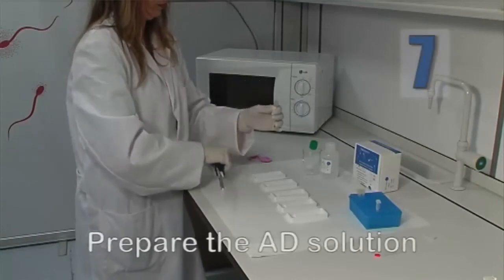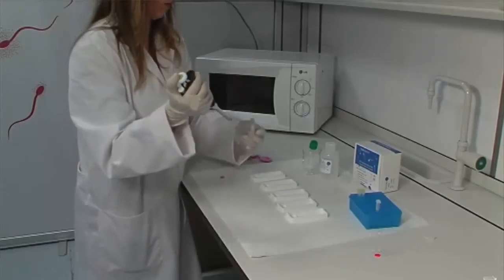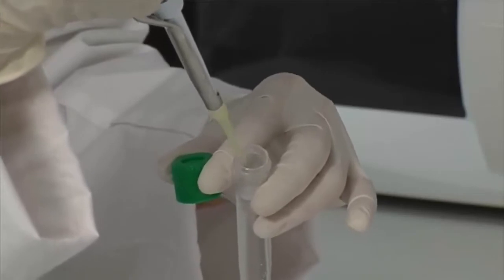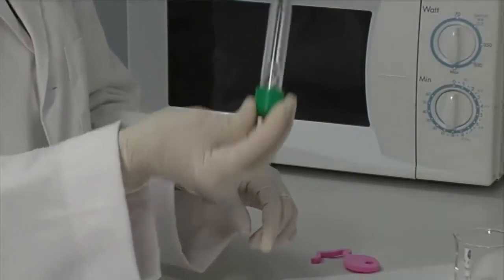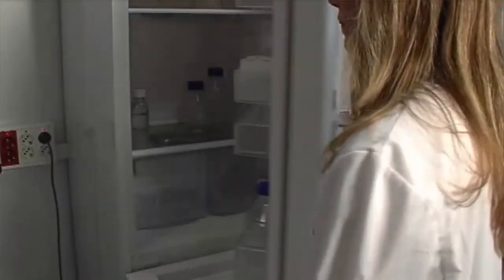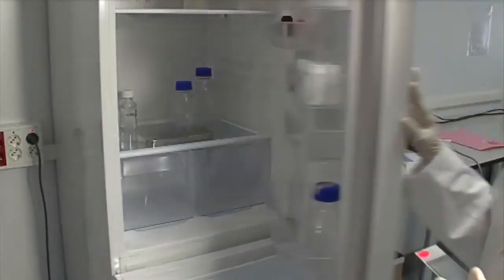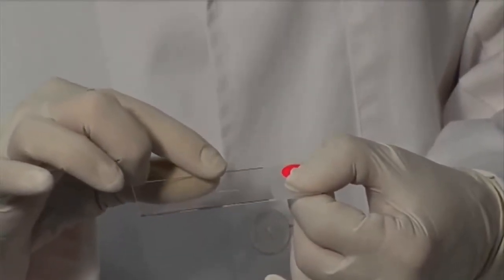Whilst the agarose is setting, prepare the denaturing solution AD by adding 80 microliters of the AD solution to 10 milliliters of distilled water. As its name suggests, the denaturing solution separates the DNA strands. Take the slide out of the refrigerator and remove the cover slip by sliding off gently with your finger. Be careful not to lift it up directly.